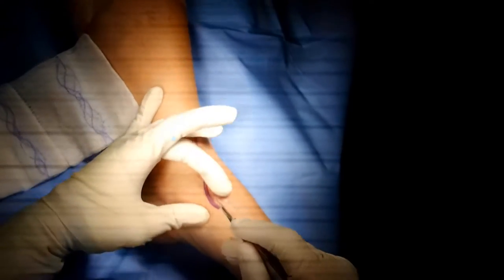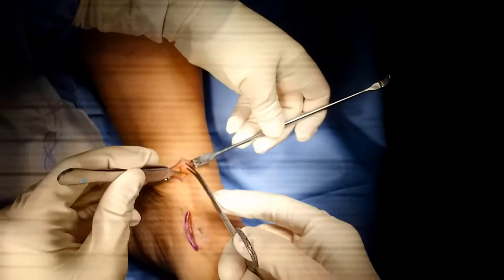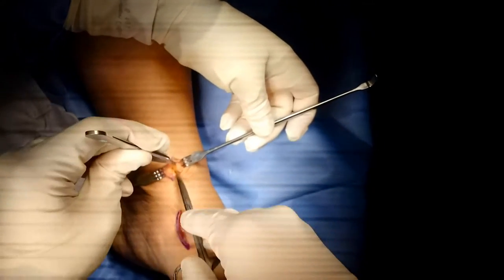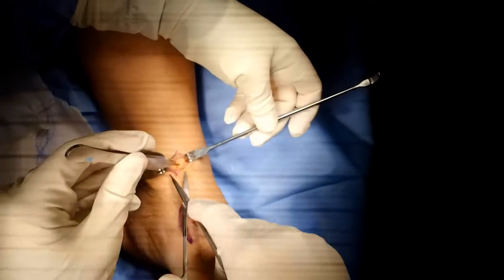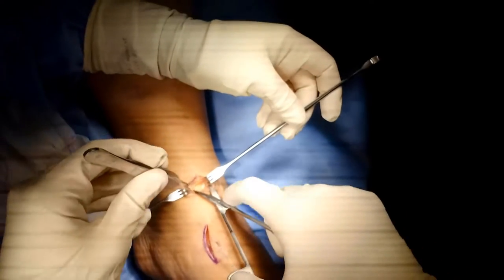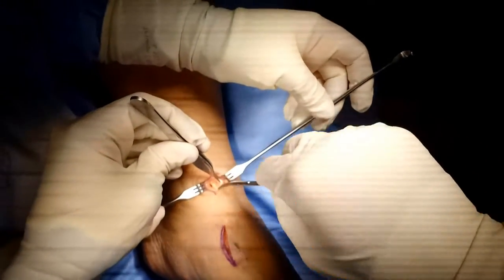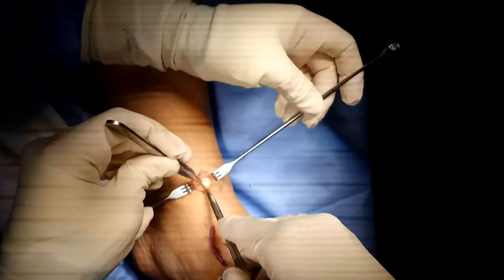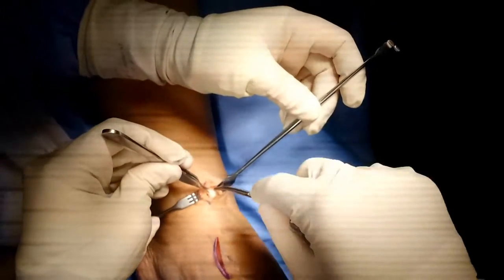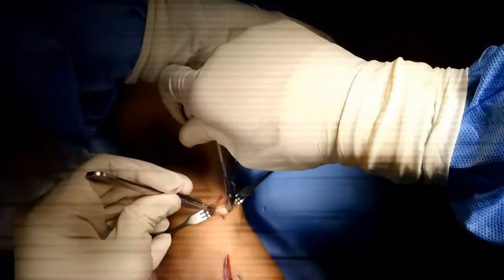At the ankle, the incisions deepen down. You'll encounter the retinaculum. Be aware of the neurovascular bundle in the area. Depending on how soon you're doing this after the injury, the tendon will typically be adhered. Here you start seeing it. It'll take a little bit of work to get it out, but usually you can get an instrument underneath it and then it will just pull out proximally.